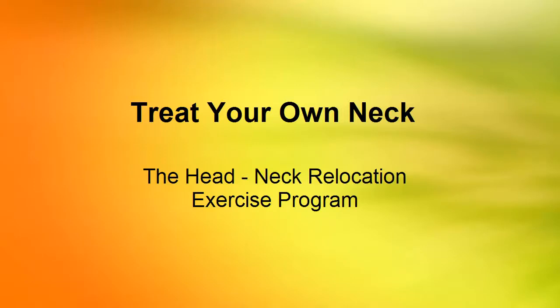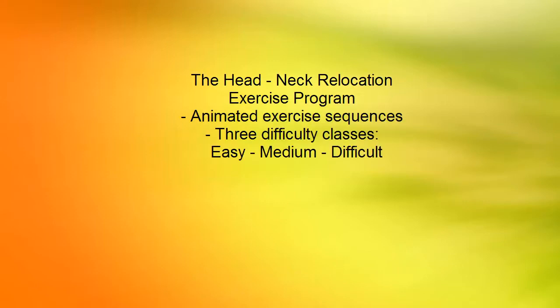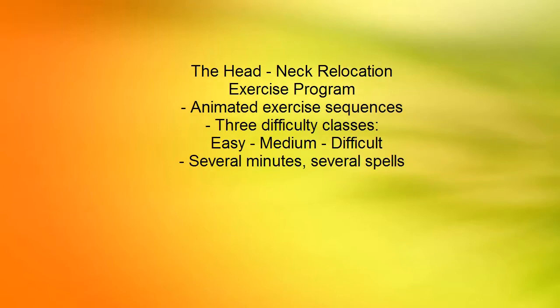The Head-Neck Relocation Exercise Program. The Head Neck Relocation Exercise program is not finished yet, but will become a part of the Neck Care unit as a plug-in. Audio-video sequences will be used to design this program through animations of each exercise sequence. The program will be divided into 3 incrementally difficult classes: easy, medium, difficult. Each part consists of read instructions and animations.